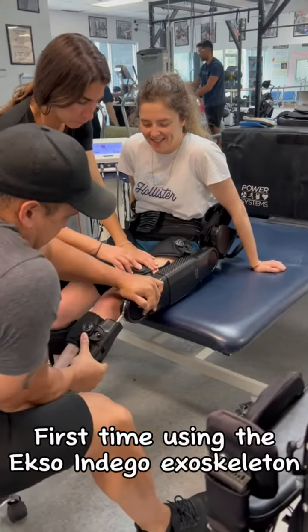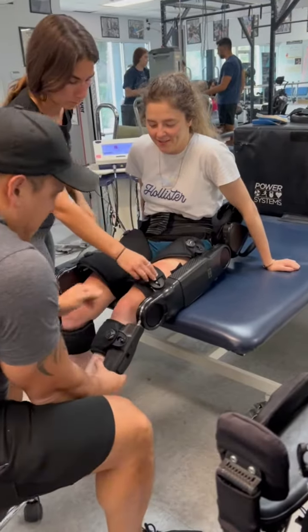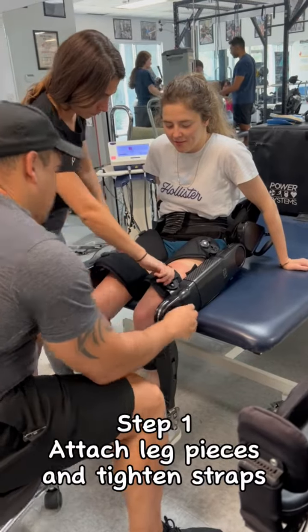First time using the Ekso Indego Exoskeleton. Step 1: attach leg pieces and tighten straps.